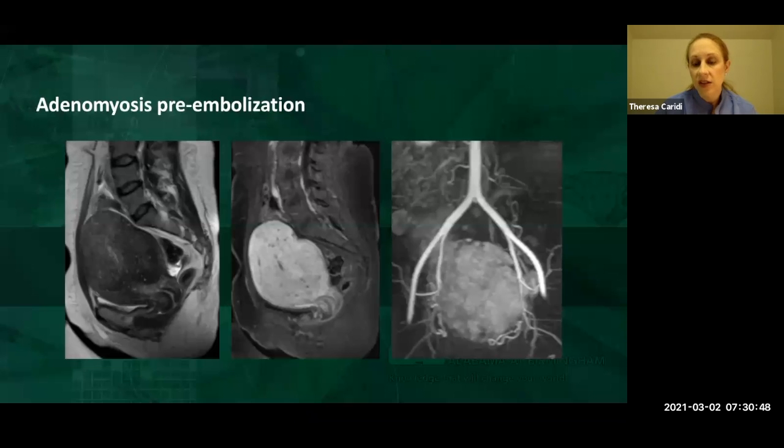And finally, on the right side, this is an MRA. The only reason why I show it is just remember that your MRAs on these MRIs can be very helpful, not only for fibroid disease, but actually for adenomyosis as well. Down below, you see those tortuous, classic appearance of the uterine arteries inferiorly. But you can also see, particularly on the left side of this patient, the radiology left, this large tortuous ovarian artery going down to the uterus. So even pre-procedurally, you're thinking about, could that actually supply the adenomyotic tissue?